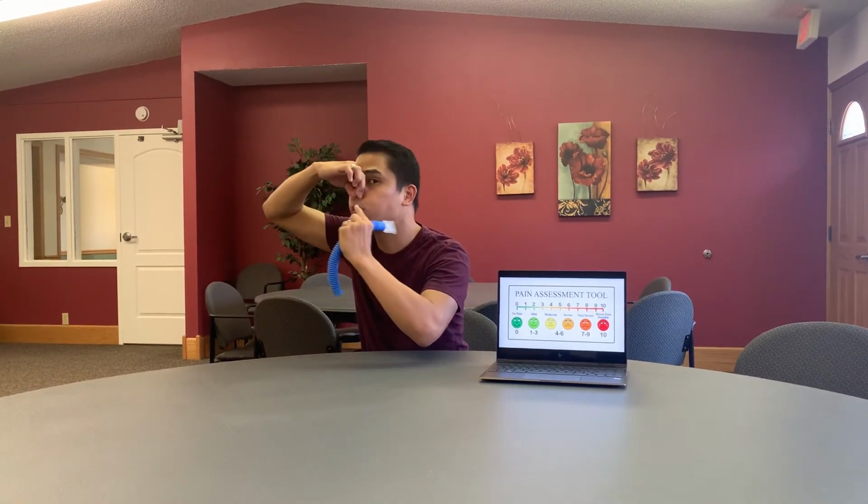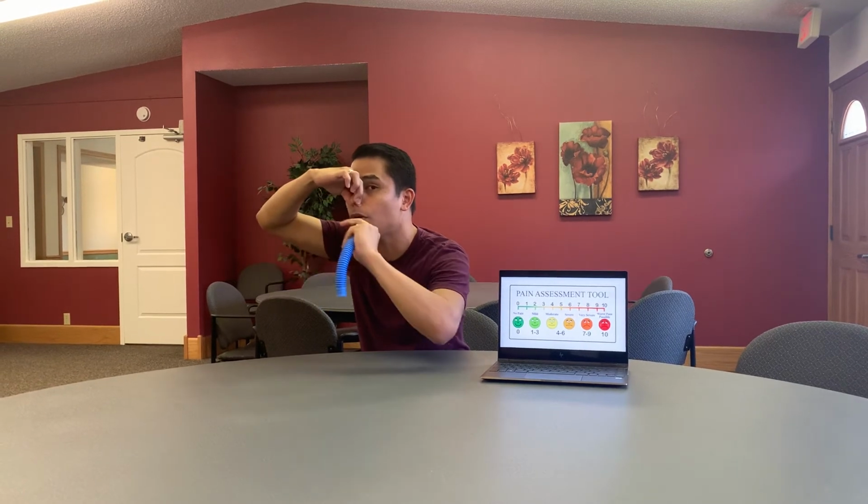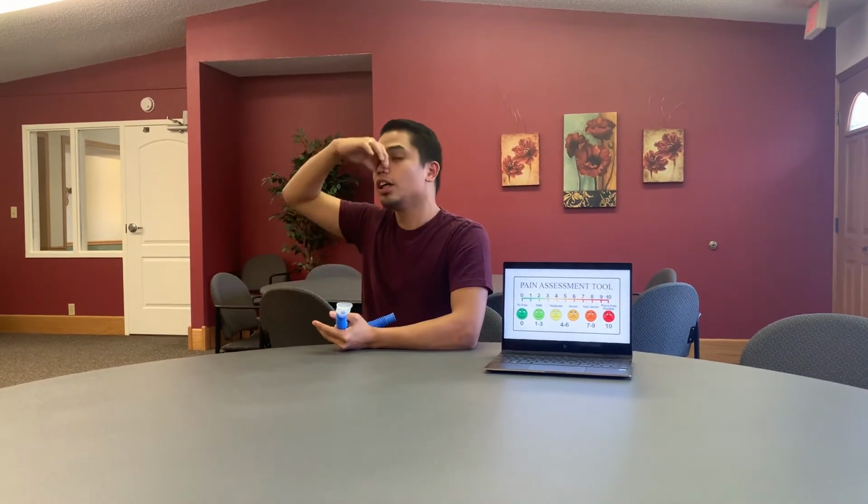Our goal is to look at the graph to see if they're able to reach 6 seconds of exhalation time. So we tell them to blow as much as you can, as hard as you can, until you feel your lungs are empty. Tell them to think of it like they're trying to blow out a birthday cake full of candles. After taking a deep breath in, blow. Continue blowing hard until you feel your lungs are empty. After blowing hard, instruct them to take a deep breath in. That's how the test is done.